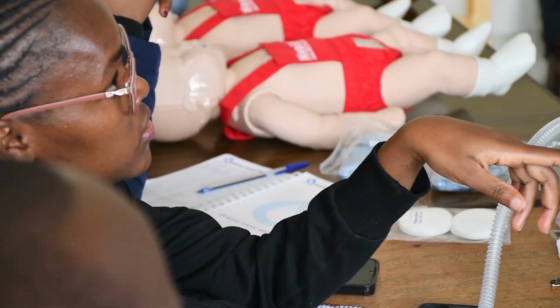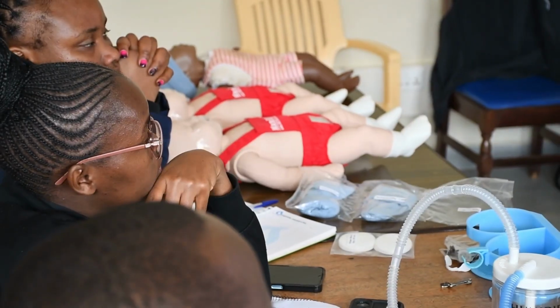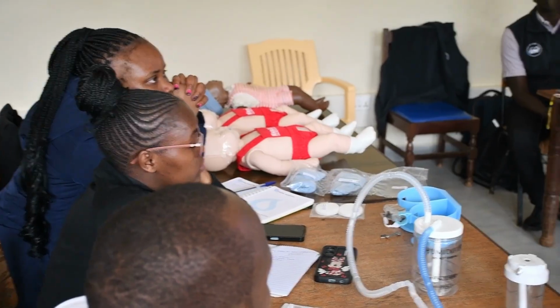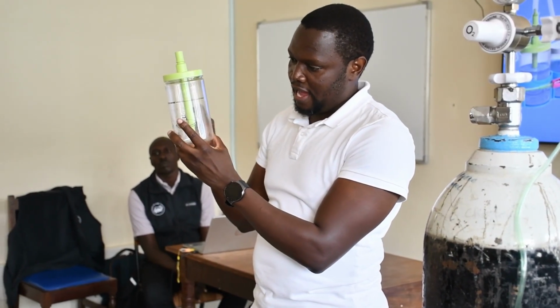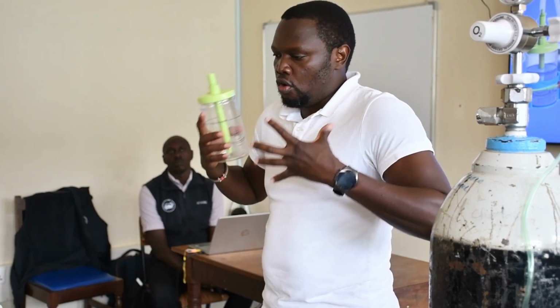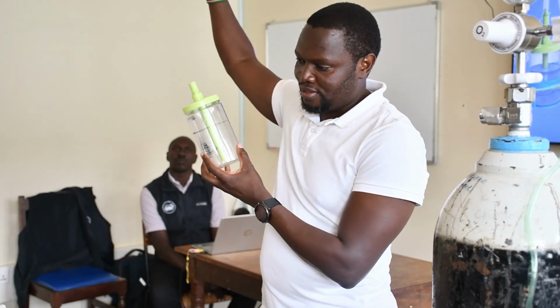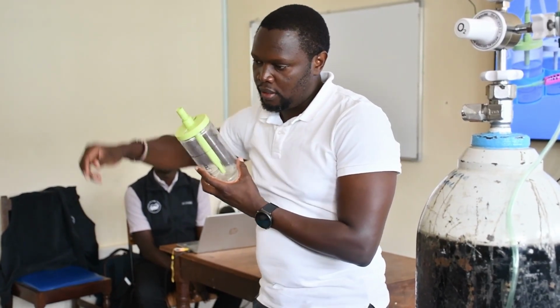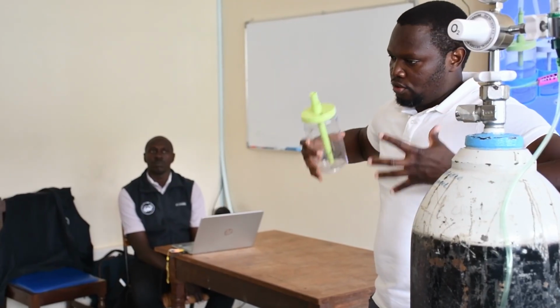So whatever the baby is exerting is going against the fluid that is here. Okay? So let's say this one is immersed all the way. It means that the pressure that it's going against is very high. Okay, so it means that they use a lot of force to try to push against this, because eventually there has to be some escaping. The gases have to escape out. Okay, because remember what we said, there's no backflow of gases. Okay, so the baby has to generate that pressure.